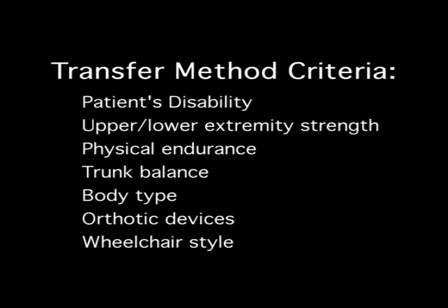In this section of the video, we will demonstrate several types of functional transfers using dependent and stand pivot transfer techniques. There are various methods for safely performing transfers.